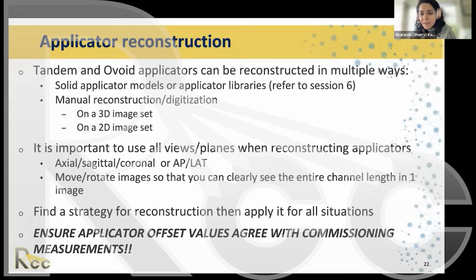Awesome. Dr. Brown, Kavuma is asking that Elekta and some other HDR vendors are promoting a unit where they can do both 3D imaging and treatment at the same position. Do you have any comment about that? Any insights? Yeah, I think it's great. Like we said before, if you could insert, image, and treat without having to move the patient, that is the best option. Very much the best option.